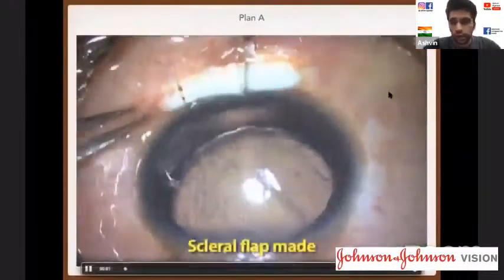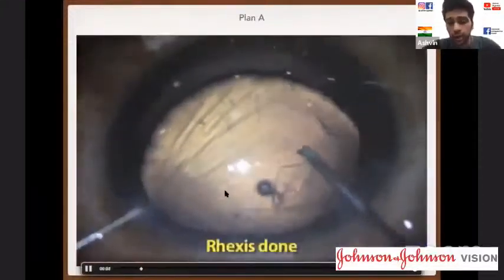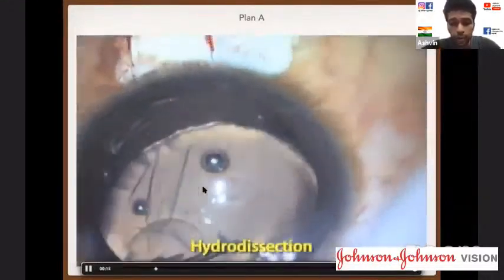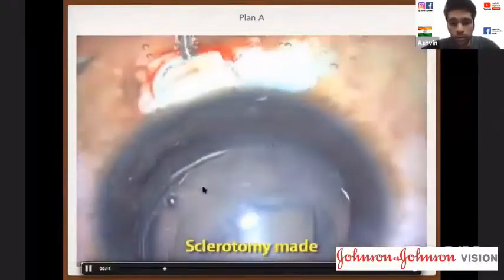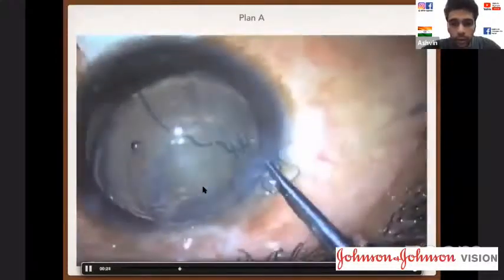Just to take things into perspective, plan A over here basically is what I do in subluxated cases, because my case of plan B is also a subluxated case. So I'm just showing you what I do after doing the rhexis. And I think Dr. Chi showed some beautiful videos, I wish, as Dr. Rohit said, I could do magical wonders like that. But no, anyways, we're mere mortals.